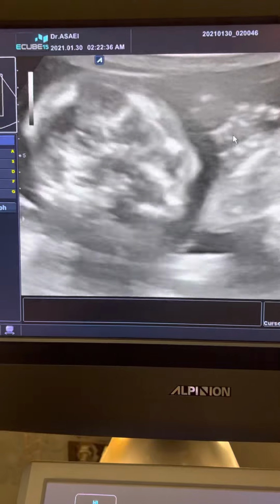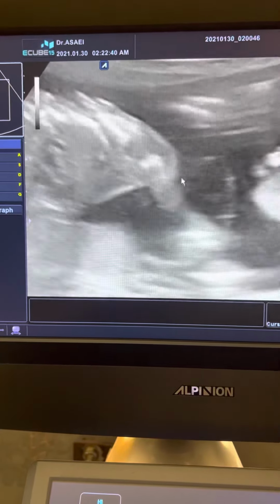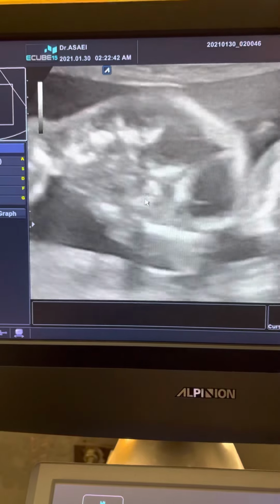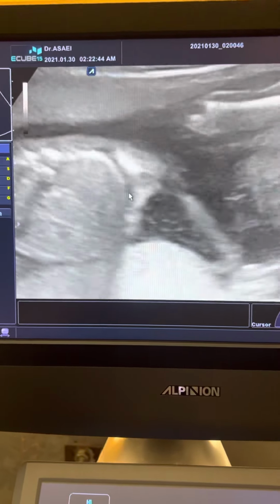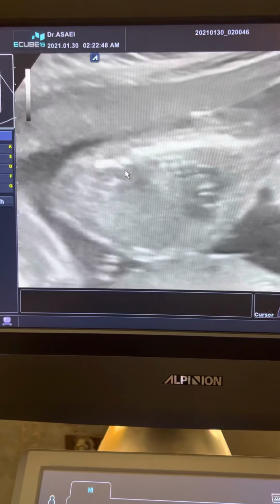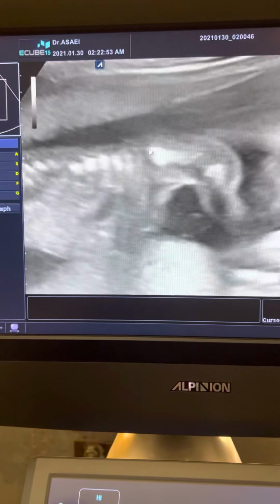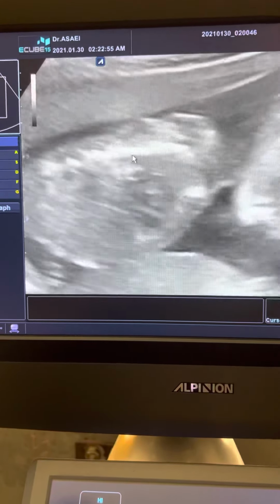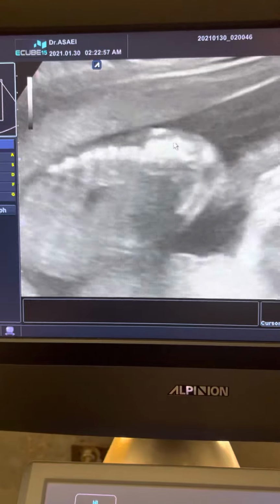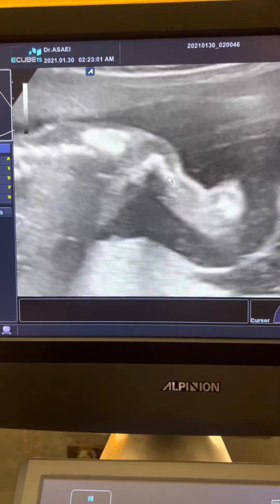So this is the hand of fetus C, easily seen, not fetus B. We are looking for the hands of fetus B. For not to be have any mistake, we can easily follow the fetus hand that we are investigating from the trunk. See here, we follow.